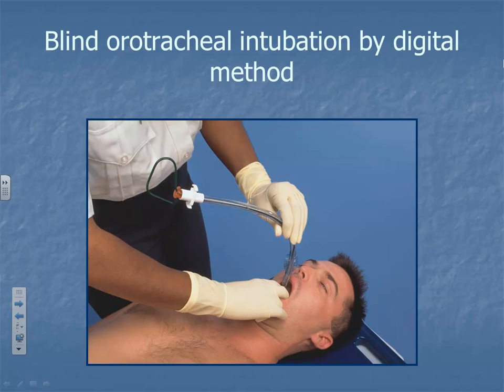But anyway, so this is a digital intubation. So you're not going to use a laryngoscope. You're not going to use a handle. But everything else is going to be the same. You notice that he does have his gloves on.